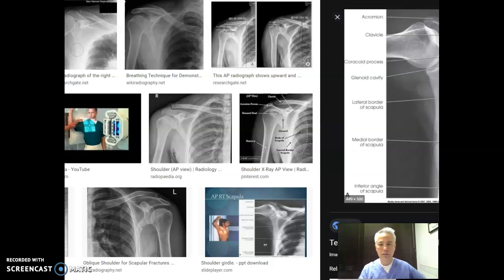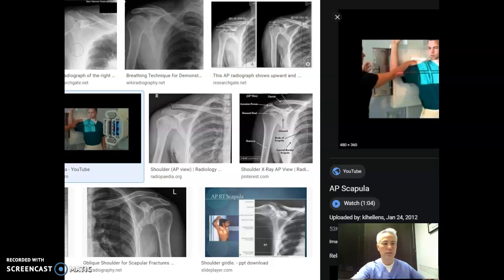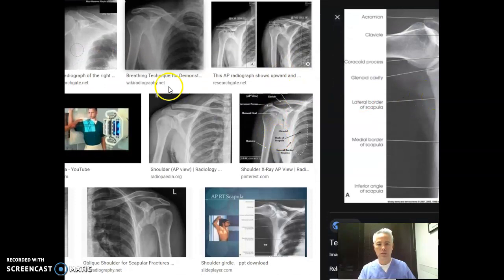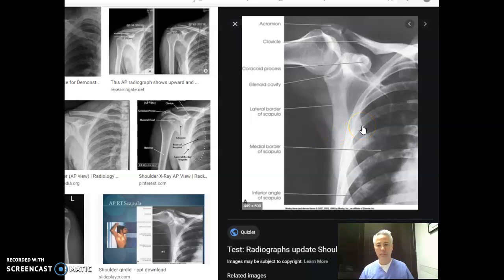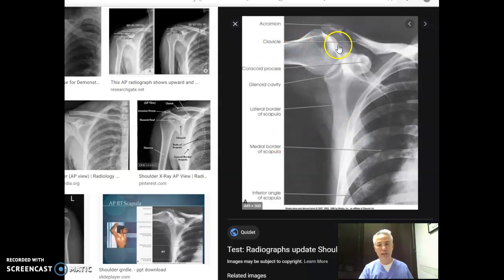Our AP scapula — basically this just wants to get an AP of the scapula. That means we do not need to get the entire clavicle. This position is basically just an AP with the hand in kind of a reverse salute position up by the head. You can see that the head of the humerus is now going sideways along with the body. That's going to angle the scapula out a little bit more so that we can see more of the surface area. We don't do scapulas as much as we do shoulders, but that's basically how you do the AP scapula.